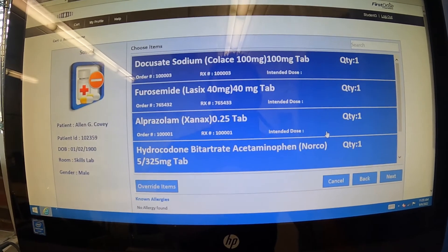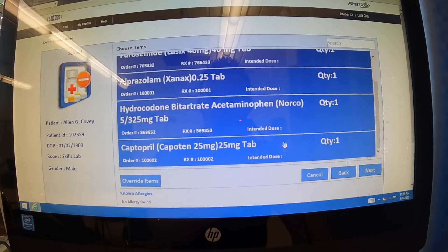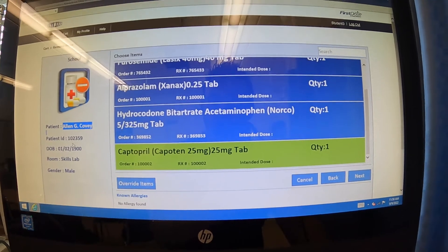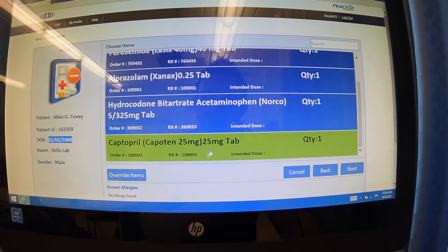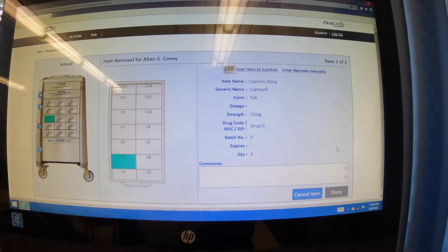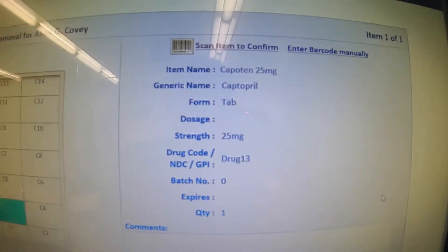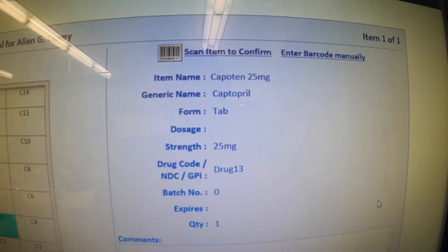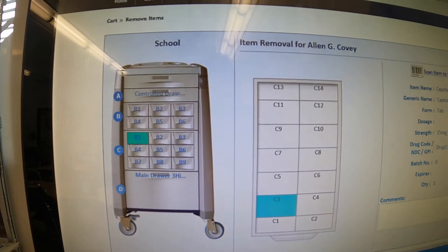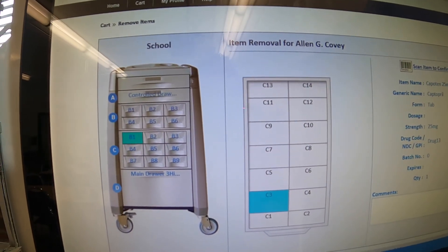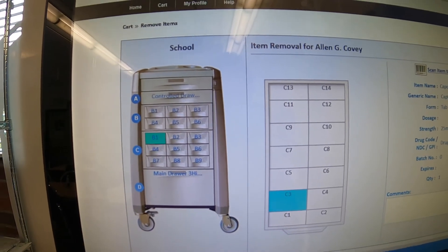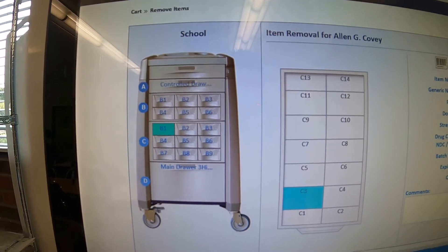For today's demo, I'm going to go ahead and pull this Captopril 25 milligrams tablet. I've double checked that I have Alan Covey here, I have the correct date of birth, and this is the correct dose listed. So once I hit that, I'm going to go ahead and hit next. This is an important screen because it again gives you the correct dosage — this is the tablet, 25 milligrams. Over here it gives you an overview of the cart, and this is going to let you know where you can find the medication and which drawer is going to open. Some hospitals it just pops the one open for you, but this one we actually have to pull the drawer.